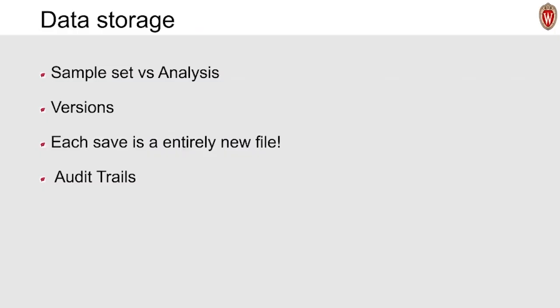Up to this point, I'm just talking about online data that exists on the server or at the instrument. We can package up the data and export it to offline data that can be moved around and backed up for long-term storage. For that offline data, we have a 24 terabyte archive space that currently has just over 12 terabytes on it from 3 years of data collection.